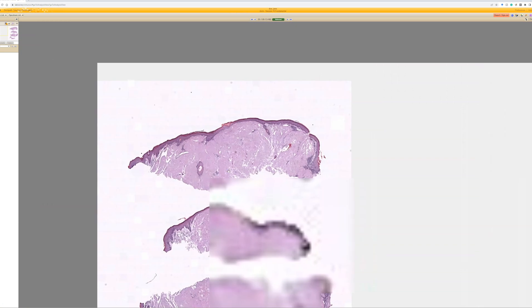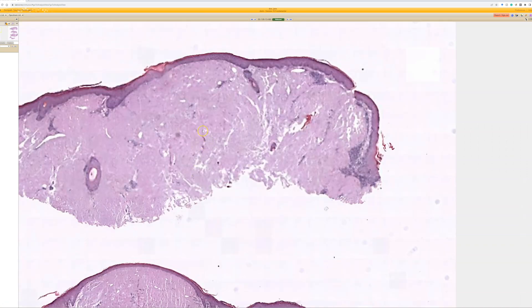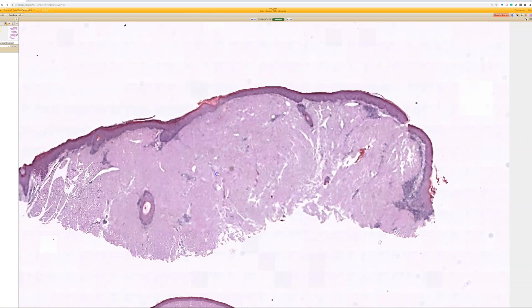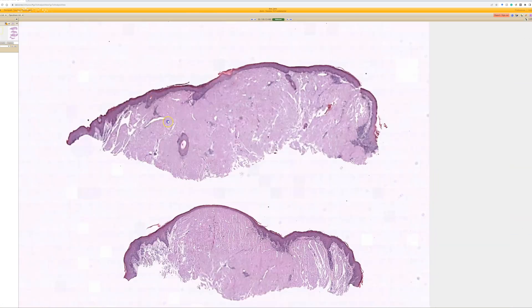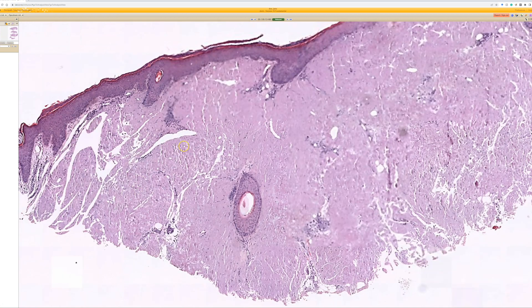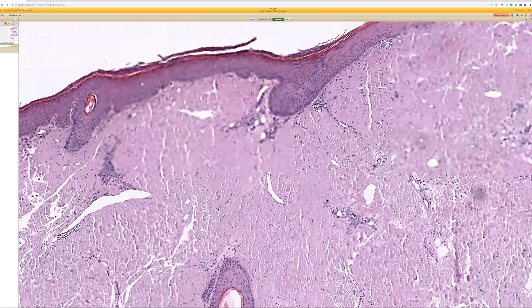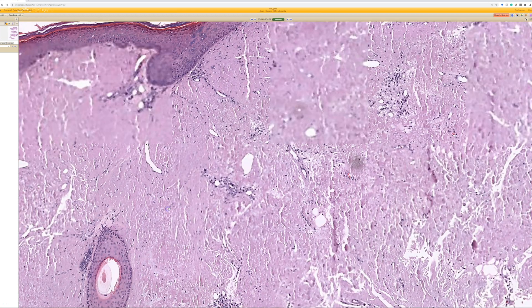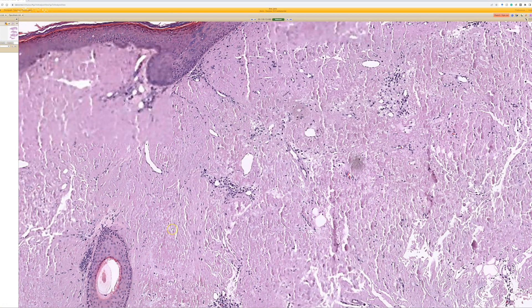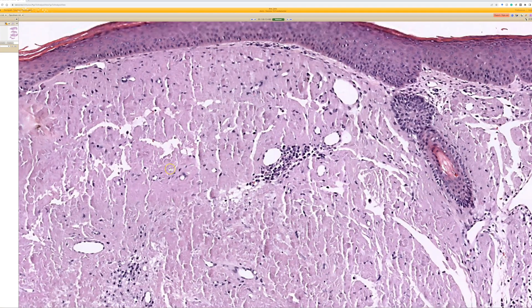Case 13. It's floating, but we can see from this top piece that the entire dermis is filled with this pink, amorphous material. It's reedy or effaced — something is pressing up on it. There's lots of fissuring or cracking, and I think this is good for nodular amyloid. This is amyloidosis in the dermis forming a nodule, which is a bit confusing terminology. Let's look at the amyloid first, then we'll talk about the terminology.